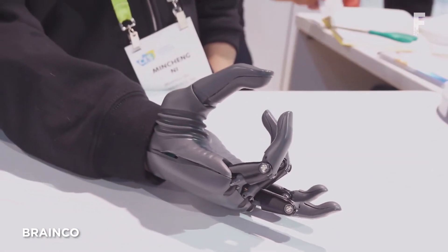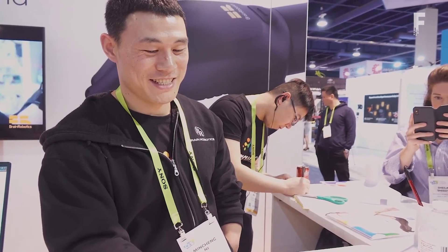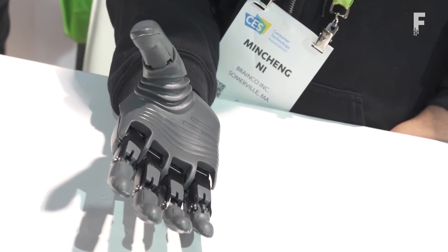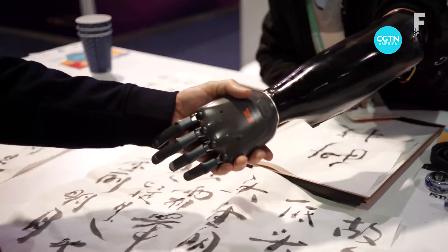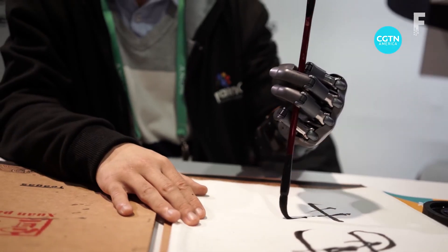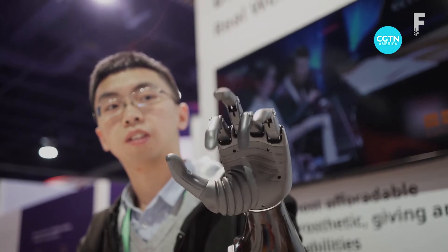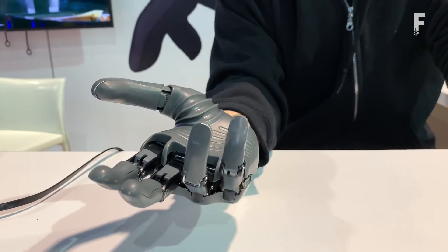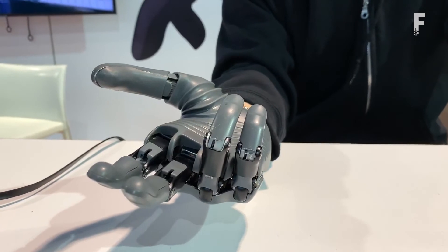BrainCo is a new AI-powered prosthetic hand that works with an amputee's brain waves and muscle signals to instinctively operate the hand. Through a software platform, the user trains the prosthetic using those electric signals to perform an unlimited number of gestures, down to moving individual fingers, even playing a piano and writing calligraphy. This means amputees no longer have to rely on a limited number of pre-programmed movements and can customize the prosthetic to their own body.